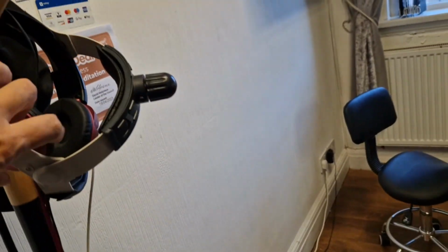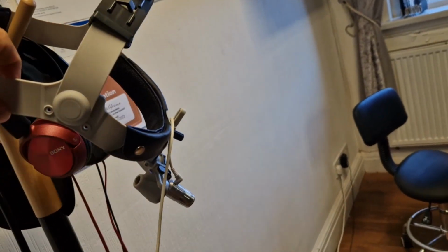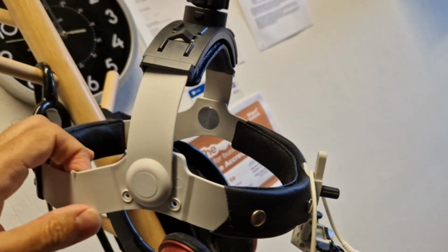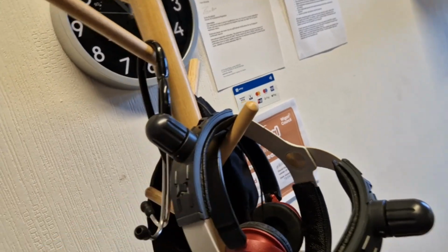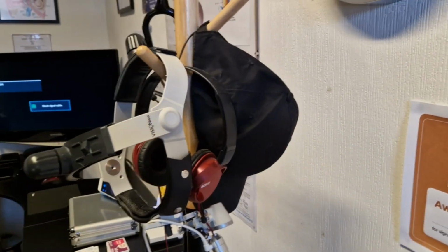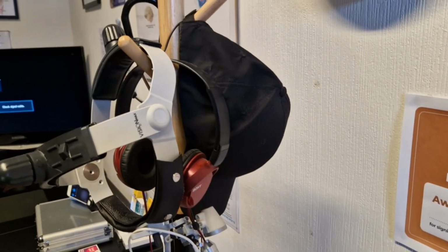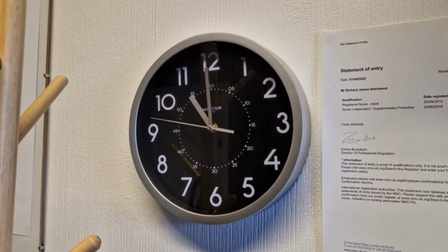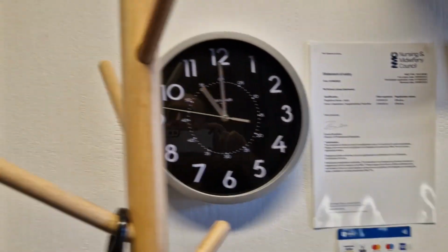Before that, a couple of business cards there. We used to use these, which are microscopes that you put over the eyes. So that's a light on the end of it, and those little, they're the binoculars. They help you zoom in, and you wear that on your head. This is Bob's hat, which actually belongs to a patient who left it here, and I can't get hold of him. It's always 11 o'clock in our clinic, because I can't be bothered changing the battery.